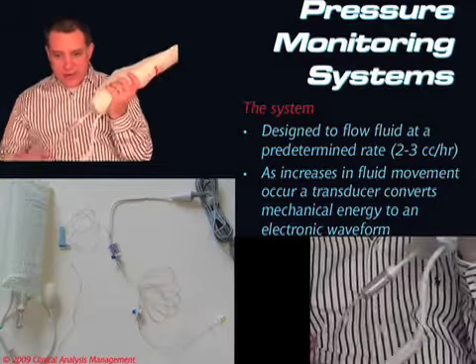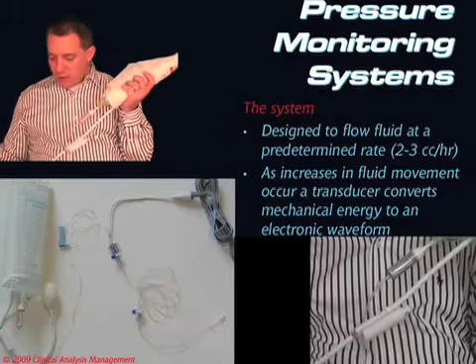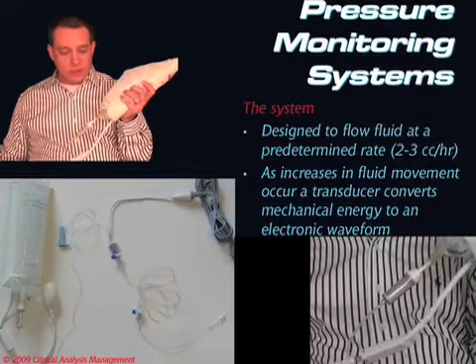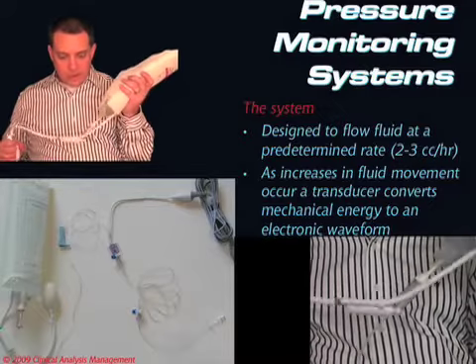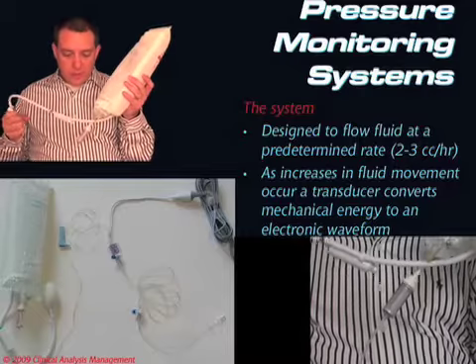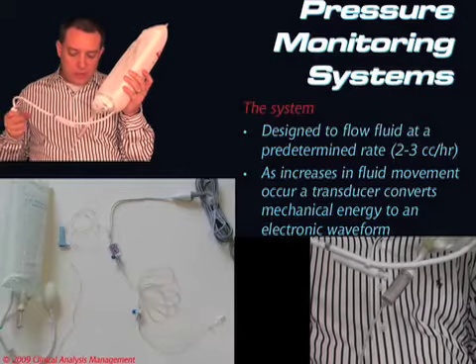remember that your pressure bags have this little pressure monitor right here. That pressure monitor was actually made for transducing pressures. So we're going to flip this to where it's open to the bag, and we're just going to squeeze it just like any other pressure bag. What we're looking for is, as this bag becomes full and that little pressure tab starts to slide out, we want this bag filled to 300 millimeters of mercury.